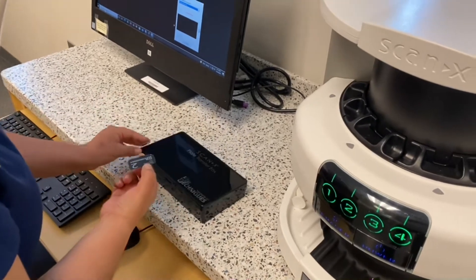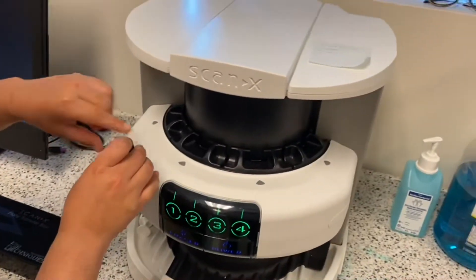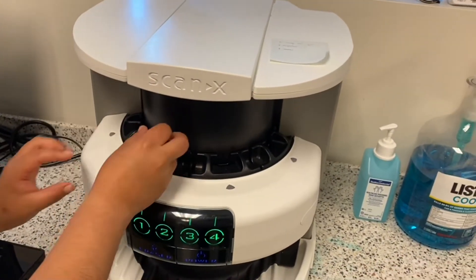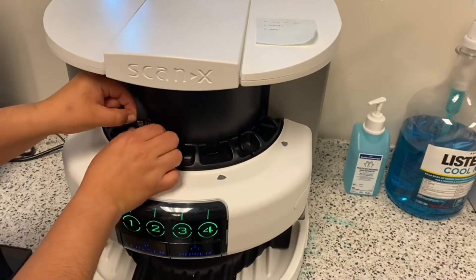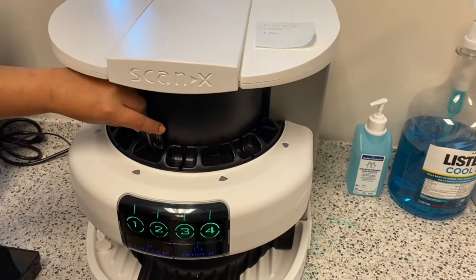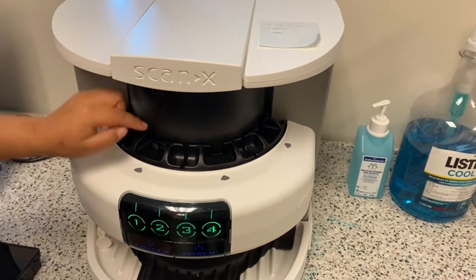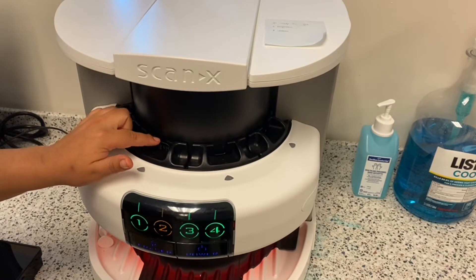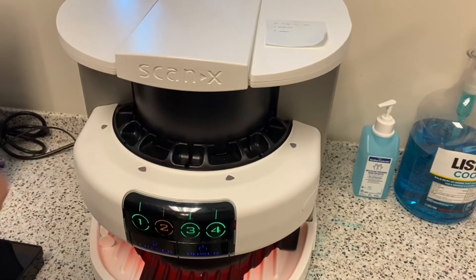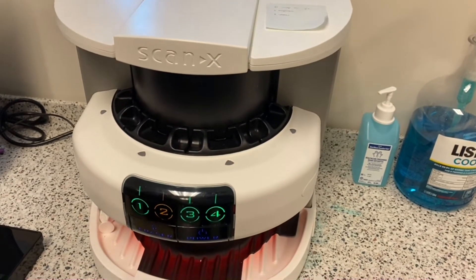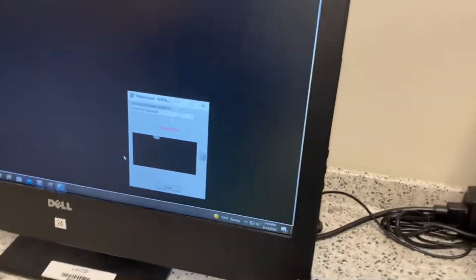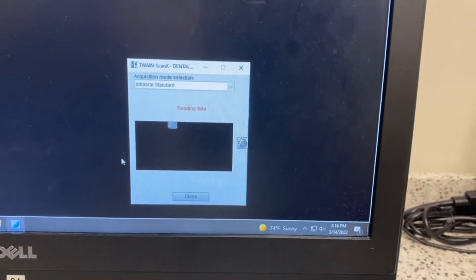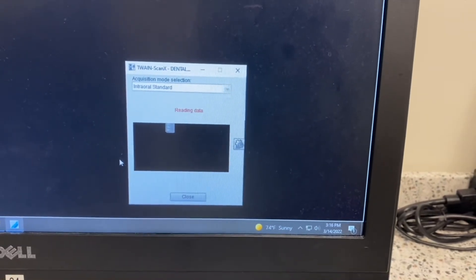And then open the box. When we grab the film, we want to make sure that the letters are facing us and that the A is at the bottom. And then that's when we process it, insert it into the little slot, push it down gently until it starts moving down on its own. Once it's developing, we'll see that the number turned into an orangey number and it'll start developing the film, as we see here.